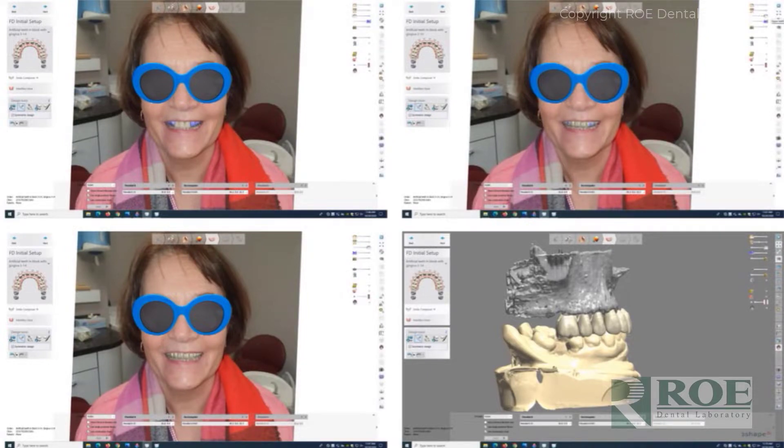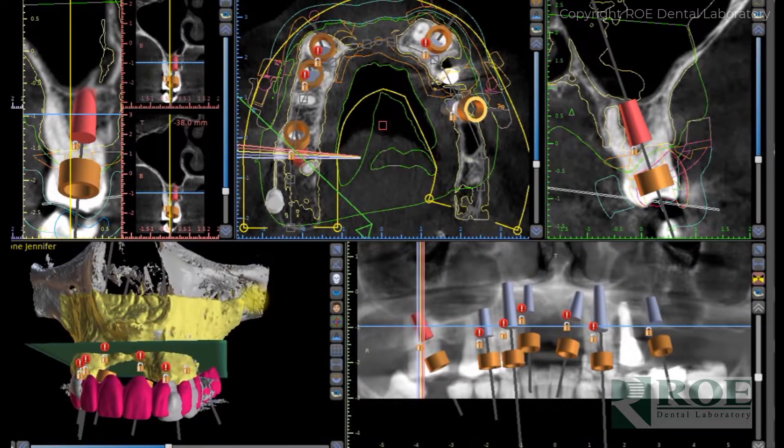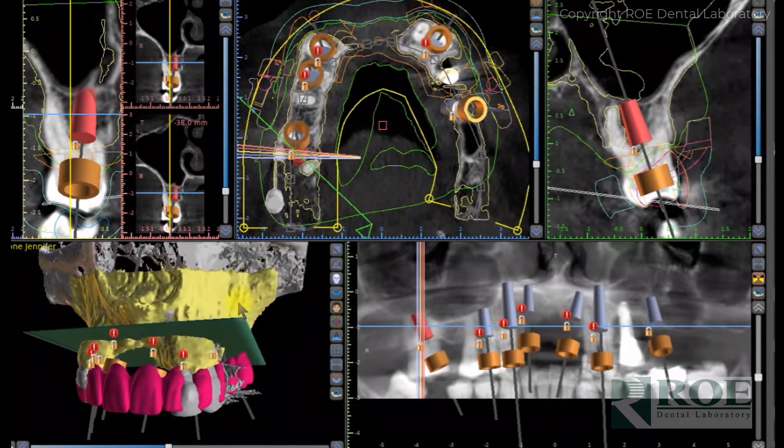After the pre-evaluation we meet the doctor online and go through that process live — online meetings for these cases run 30 to 45 minutes and we go through every aspect of the case. In this case we used Blue Sky Plan, and you can see all the files.